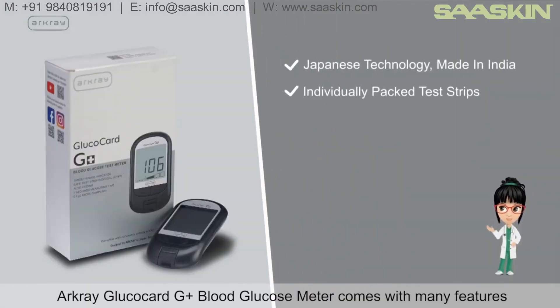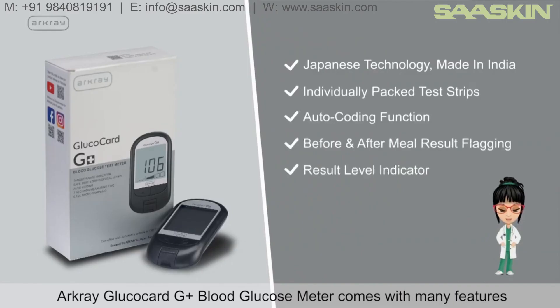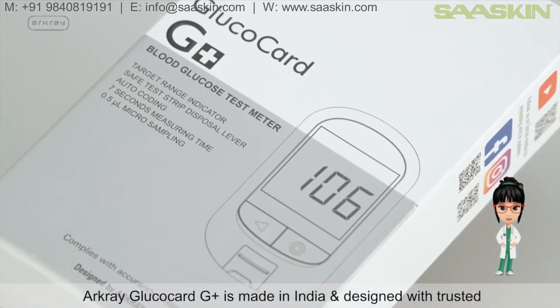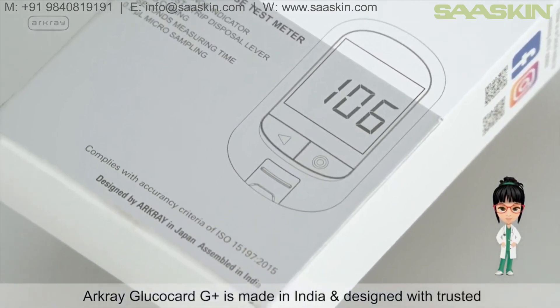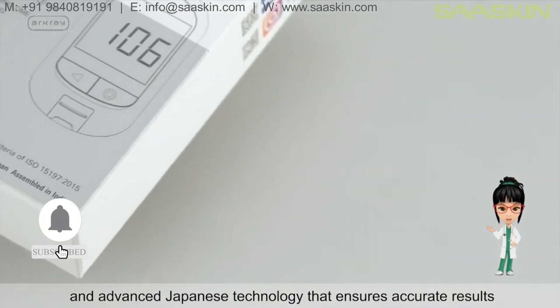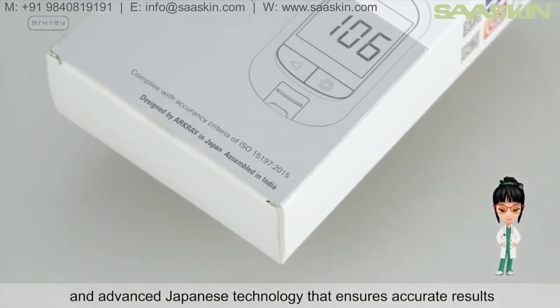R-Cray Glucocard G Plus Blood Glucose Meter comes with many features that make diabetes management easy. It is made in India and designed with trusted and advanced Japanese technology that ensures accurate results.